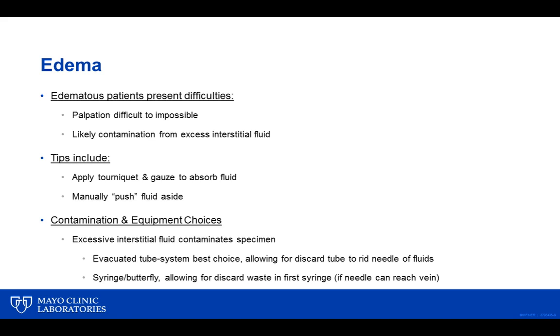I would suggest, depending again on the severity of the edema, that you first try it prior to placing the tourniquet, but have the tourniquet under the arm, ready to apply as soon as you push some of the fluid away. Or on a severely edematous patient, you may actually have to place the tourniquet and then use that pushing technique, manually moving the fluid away from the antecubital area as you look for a vein.